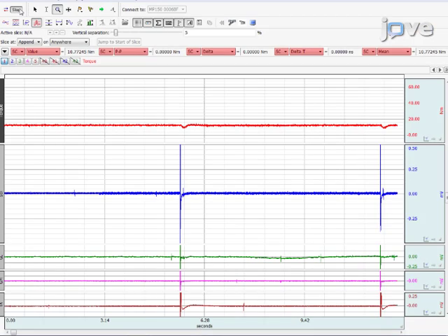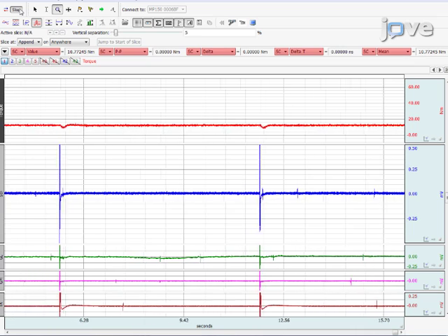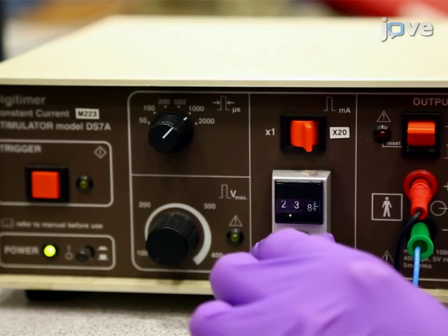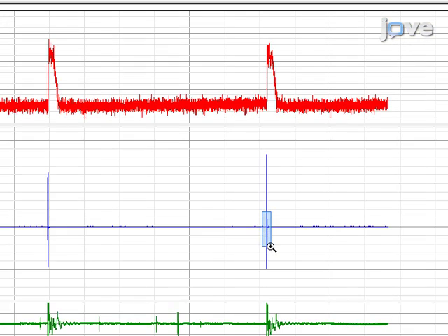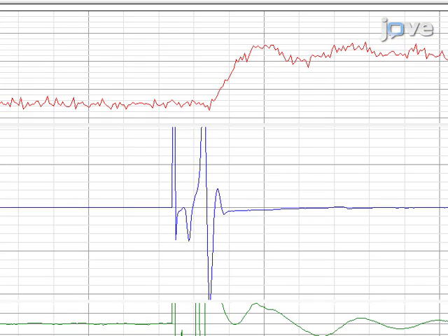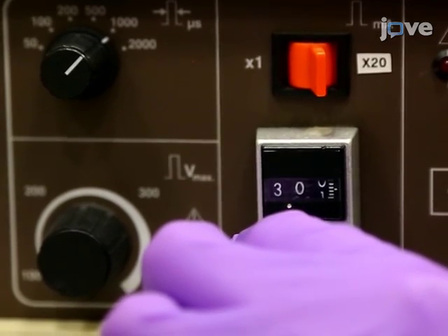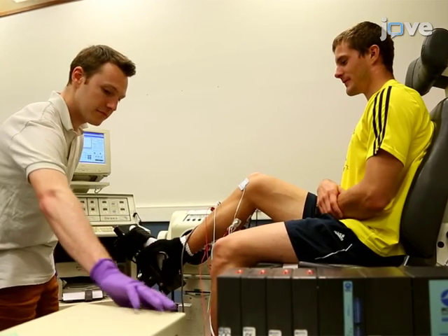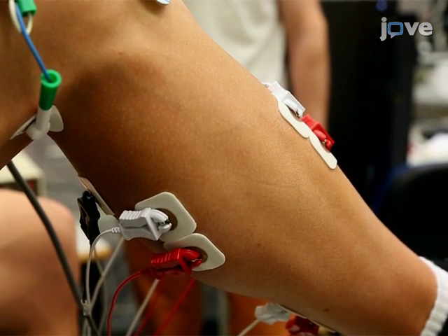Pause at least 3 seconds between stimulations to avoid post-activation depression. Next, increase the intensity to between 40 and 100 milliamps to get the maximal soleus M-wave amplitude. Once determined, increase the intensity by 20 to 50% and deliver 3 supermaximal stimulations. Record the twitch torques associated with these stimulations.